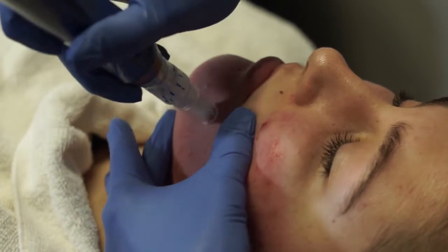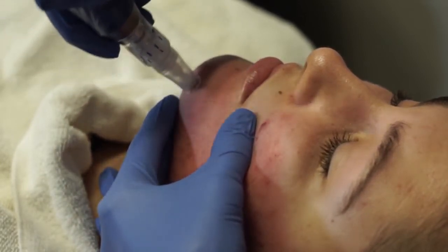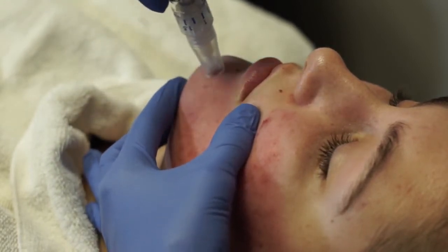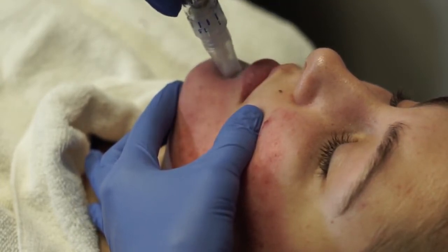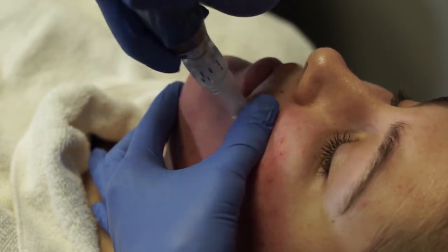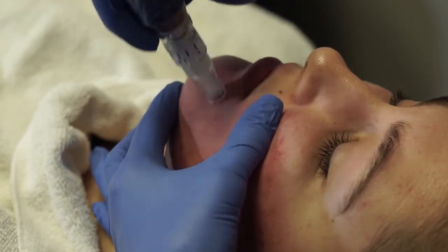If you choose to use numbing cream to improve patient comfort prior to a treatment, make sure you or the patient apply the numbing cream in all areas to be treated, right up to the edge of the treatment area. This can be an especially important detail when applying cream around the lip area, as patients often leave this highly sensitive area untouched, which may be felt later during the procedure.